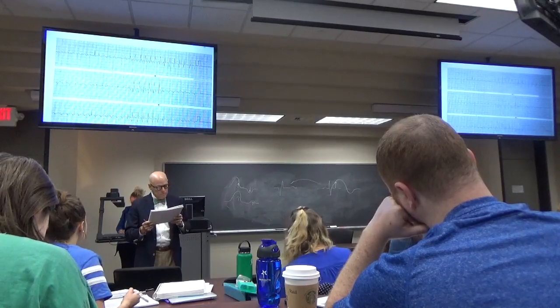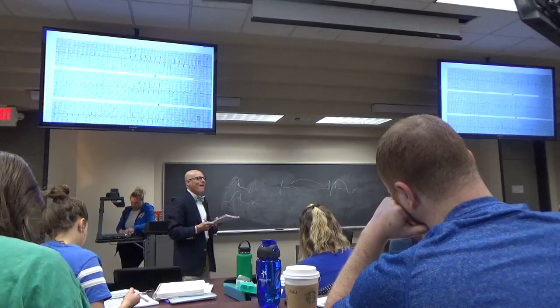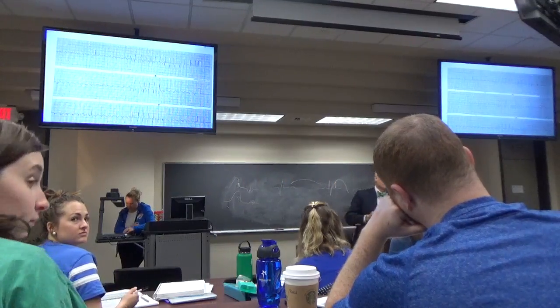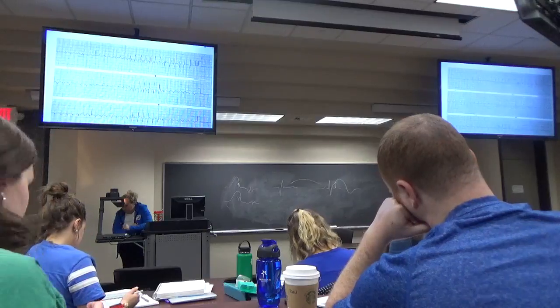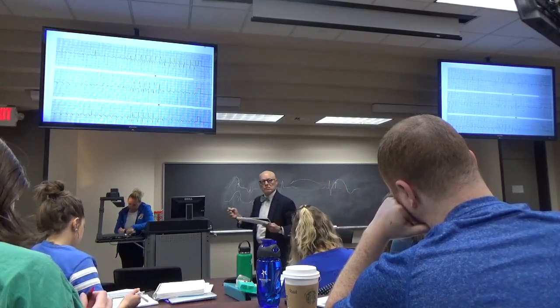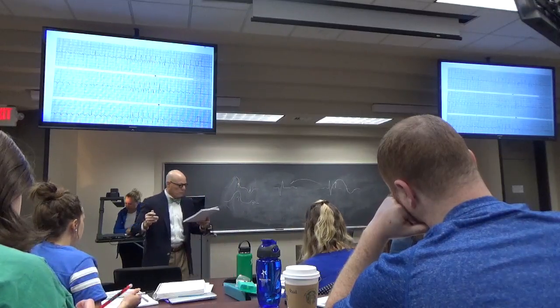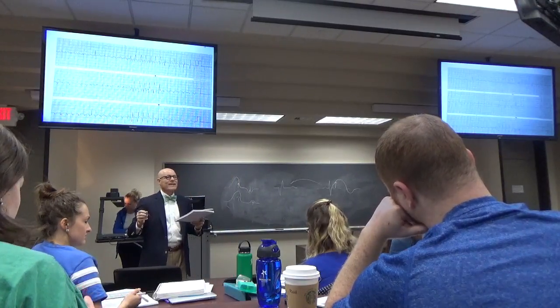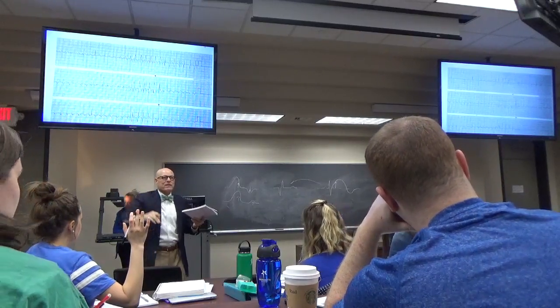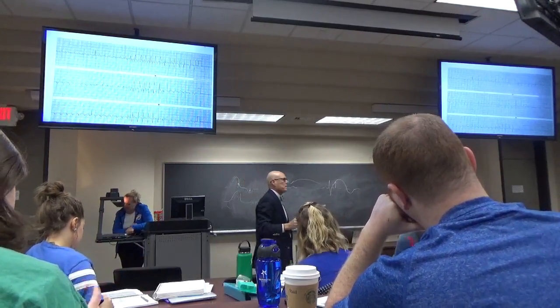Well, what's the QRS? Who read this? You gotta own up. What's QRS? I got 0.12. 0.12. So is there a bundle branch block? No. I got 0.12. How many got a bundle branch block here? About a third of the class. I got a bundle branch block here.